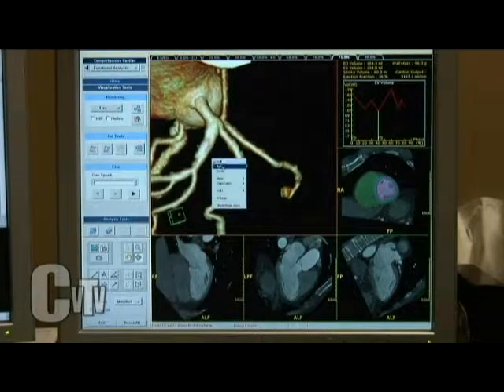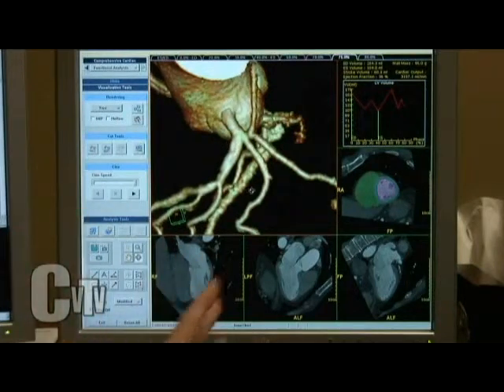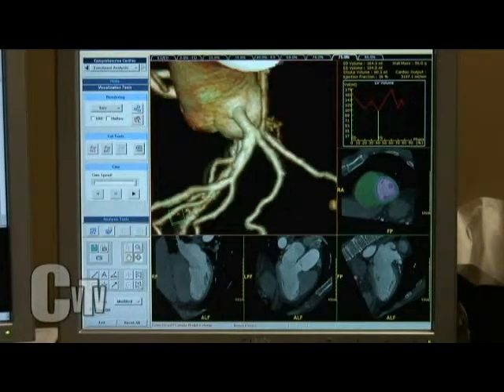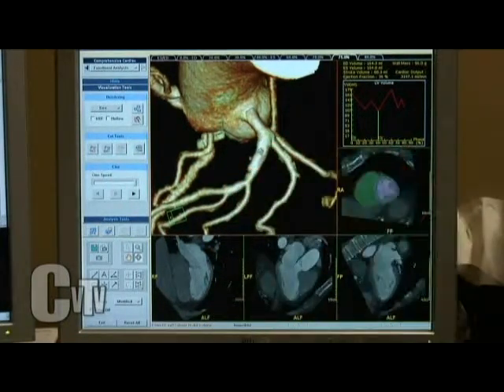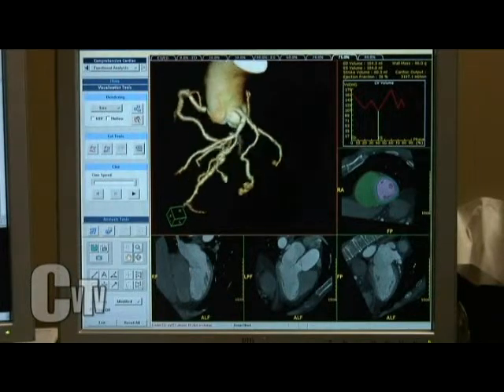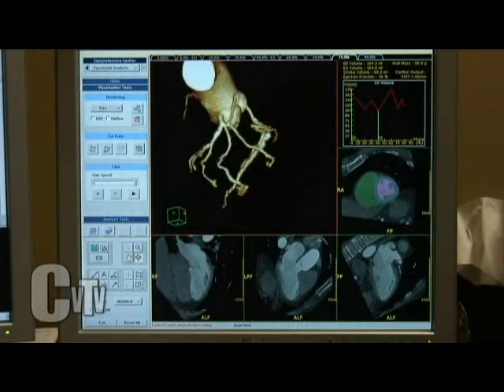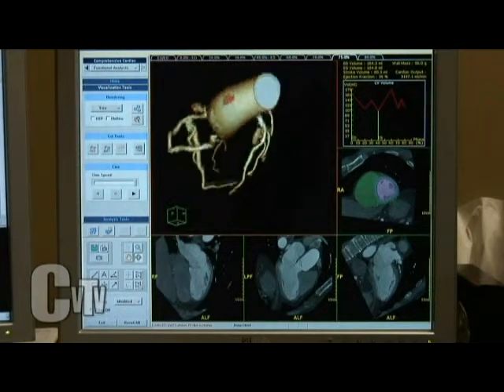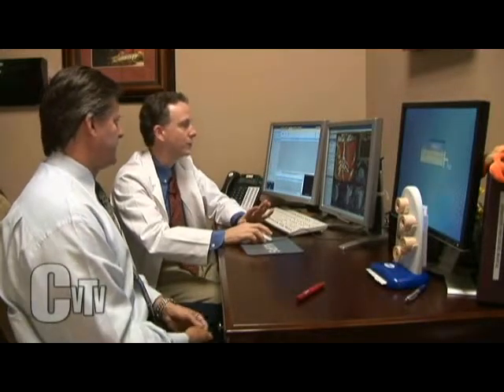Hopefully, I think we got it just in time, but had that plaque begun to grow any further into the blood vessel, that's when he could have had a heart attack. And if it broke open right here and a blood clot formed, that's just all she wrote. Right. You're going to lose all of this. See how much of that heart that blood vessel there supplies. That's a big heart attack, and could even be a fatal heart attack. So we do the coronary tree, and that's what it looks like, and we can spin it around.